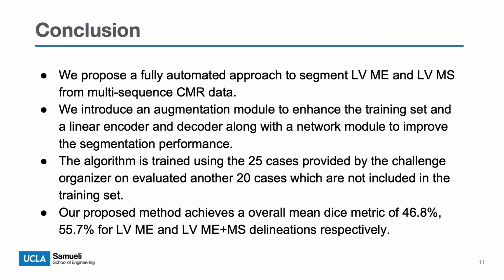In conclusion, we propose a fully automated approach to segment the LVME and LVMS from multi-sequence CMR data. We introduced an augmentation module to enhance the training set and linear encoder and decoder along with the network module to improve the segmentation performance.